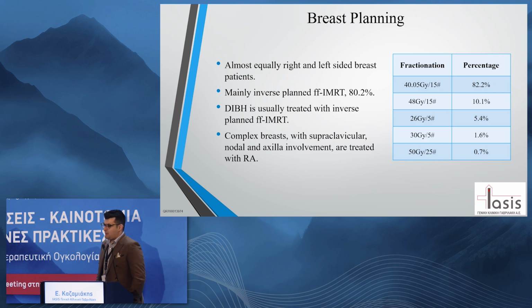We are treating almost all our simple breast patients with fixed field IMRT, mainly, and the same applies for DIBH as well. And we are treating complex breasts, breast with SCF, breast with IMC, breast with axilla, with RapidArc. And our most common fractionation scheme is the 15 fractions from IMPORT High, and we're also implementing the FAST-Forward protocol.